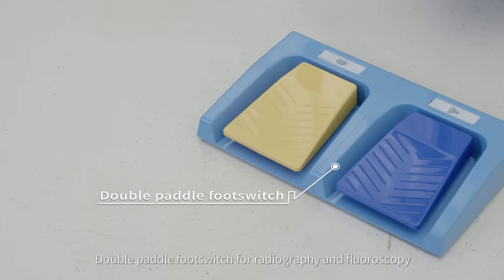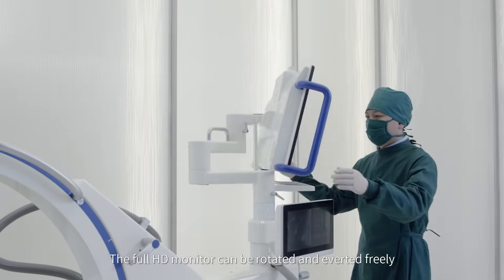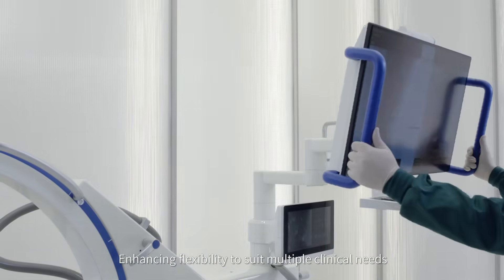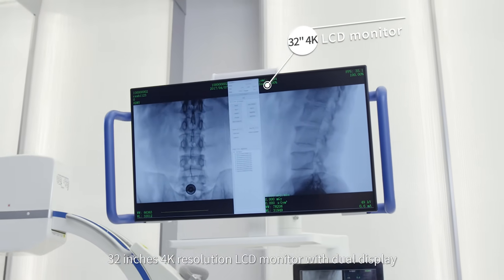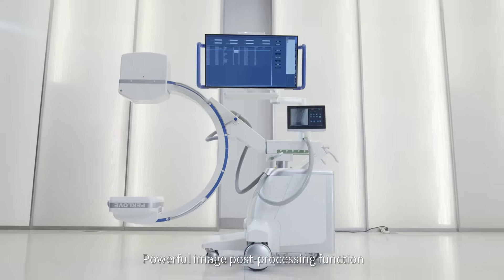Double pedal foot switch for radiography and fluoroscopy. The full high-definition monitor can be rotated and averted freely, enhancing flexibility to suit multiple clinical needs.